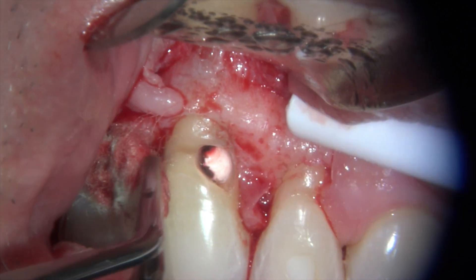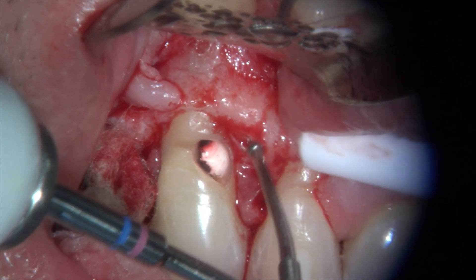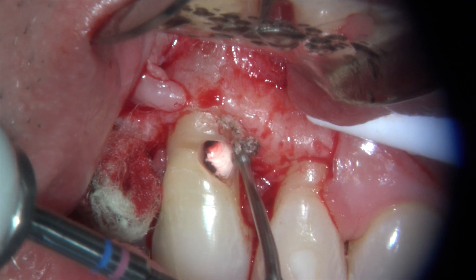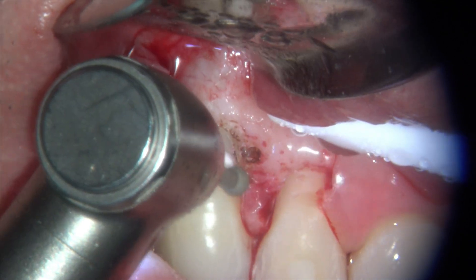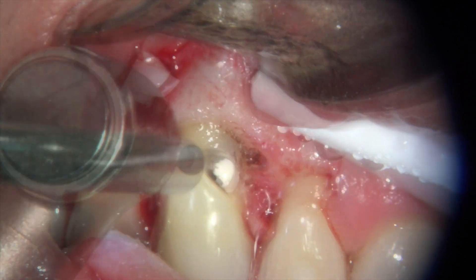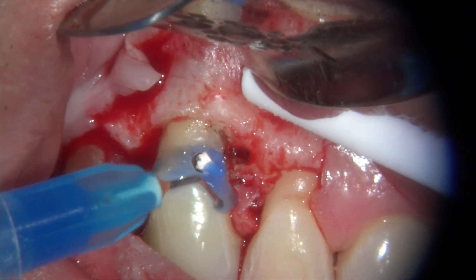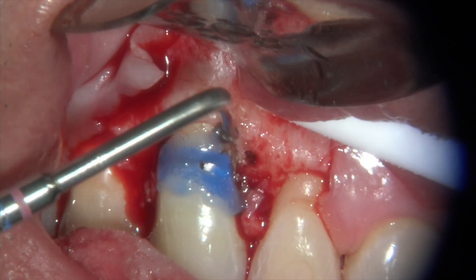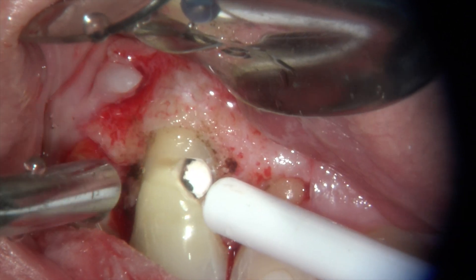If there's still bleeding, cautery is used — you can use lasers or just heat — to stop the bleeders. The opening is enlarged and a bevel is created to give better retention for the BC liner, which will bond to both enamel and dentin. While BC liner is a self-etching and self-bonding material, in this case — since you'll be dealing with shear forces — some etching is preferred. Full bonding with a bonding agent would be ideal, but this area is difficult to isolate from a bleeding standpoint.